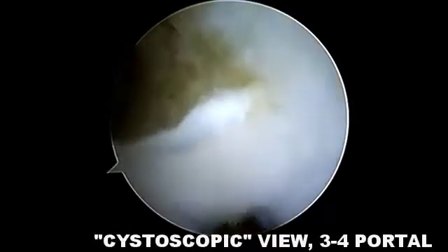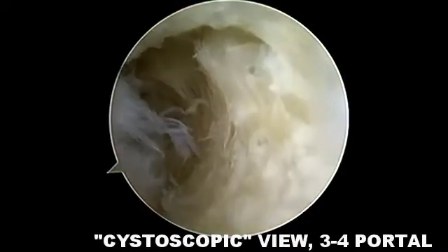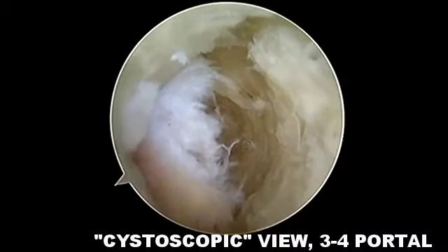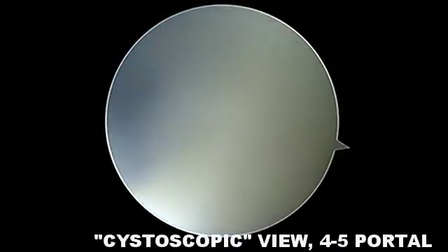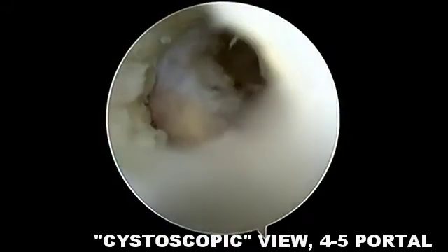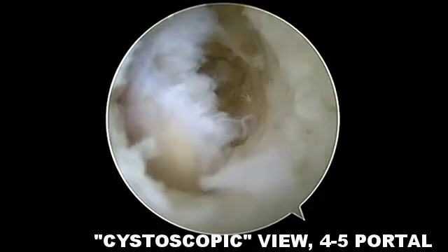The arthroscope is now advanced into the lunate drill hole through the 3-4 or the 4-5 portal and the intraosseous ganglion cyst contents are visualized. The 4-5 portal offers a linear trajectory into the lunate, allowing the arthroscope to be advanced further into the cyst.